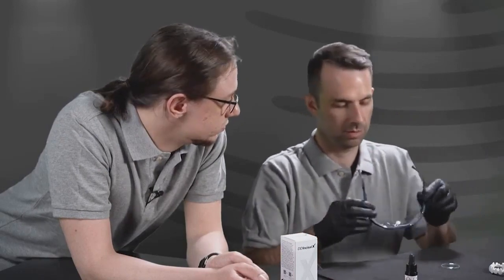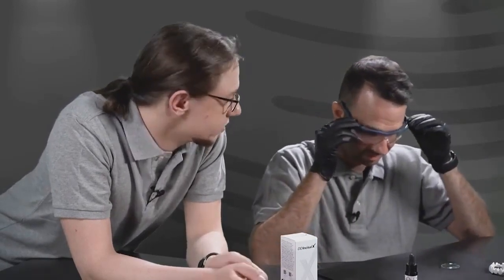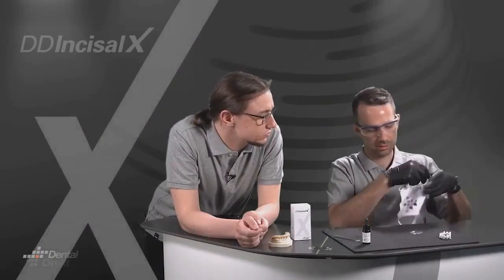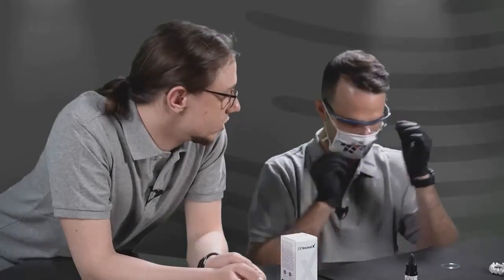I agree. While we're here, definitely, I'd recommend some goggles. Self-protection, always very important. And then on top of that, we're all used to it by now, I would also recommend a mask. A protective mask is also good, and not just because of the liquids, but also because of the dust. Yes, exactly. Preferably from Dental Direkt, of course. Exactly, we have that here too.